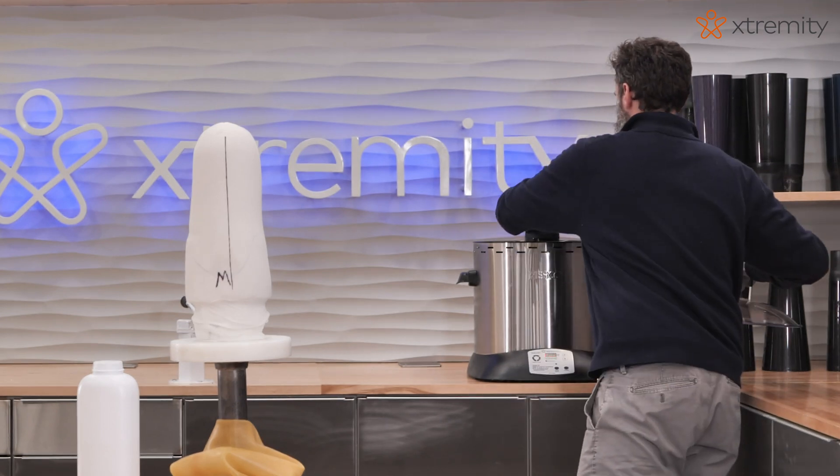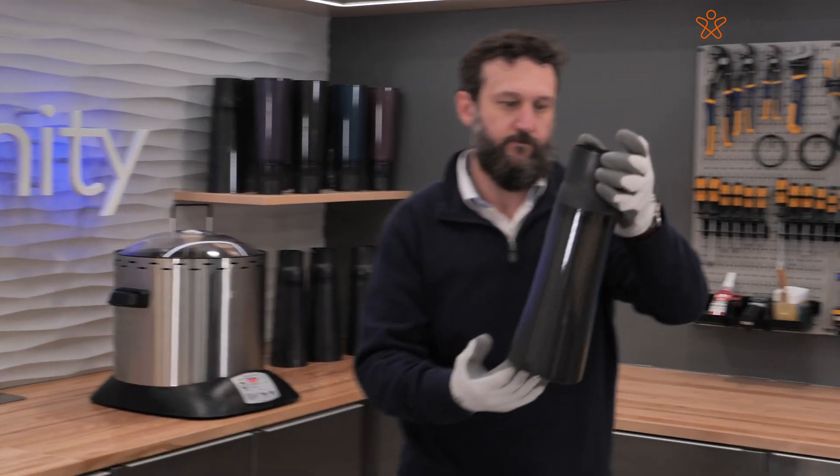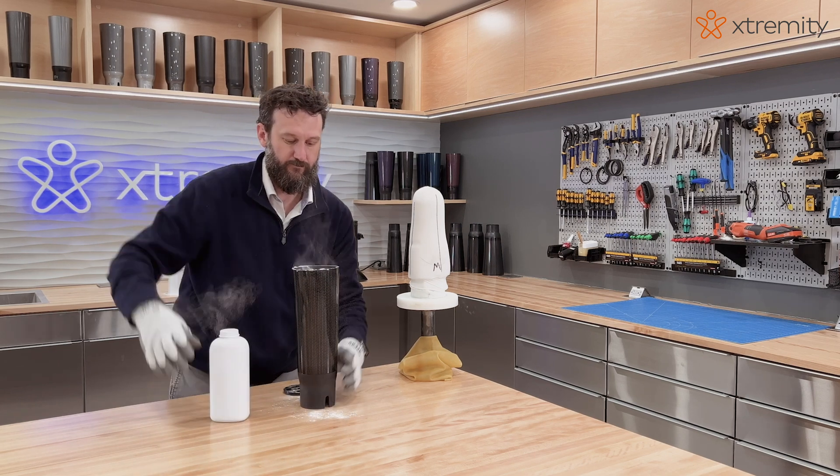Ensure all supplies are laid out next to the vacuum stand. Once the timer alarms, remove the socket from the heating unit by the socket base. Apply powder to the inside of the socket and gently pre-stretch.